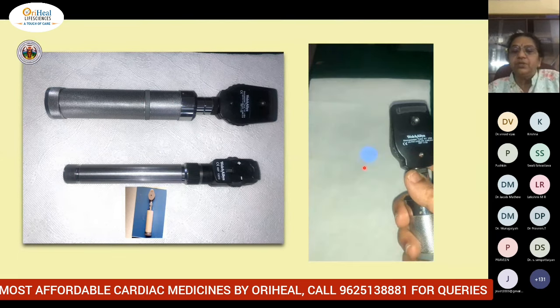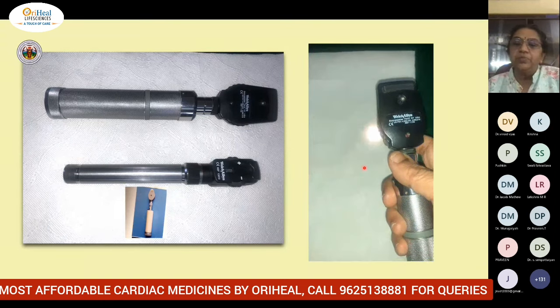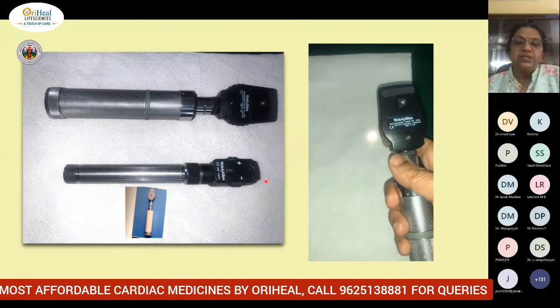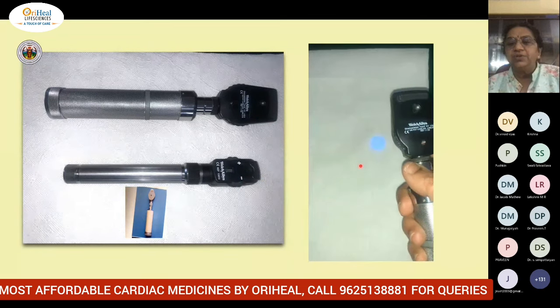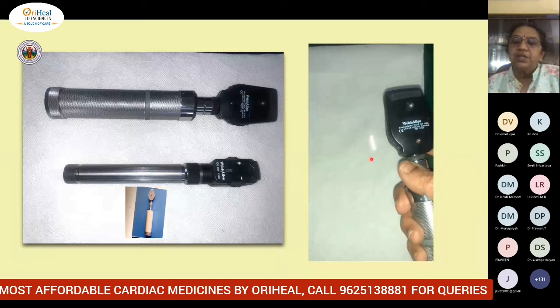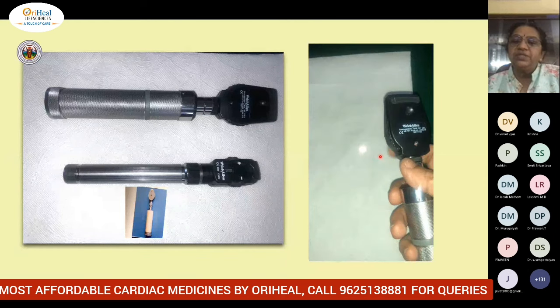So this is the blue one, and the blue one is very important. Some direct ophthalmoscopes come without this blue. For example, this pocket type doesn't have it, so you will not be able to use it on a corneal ulcer case. Slit is also there, and these are different apertures of different sizes.